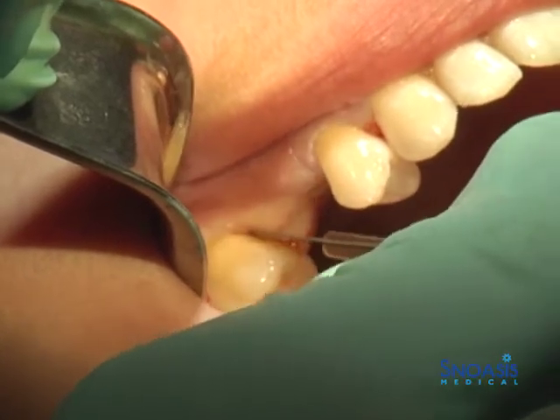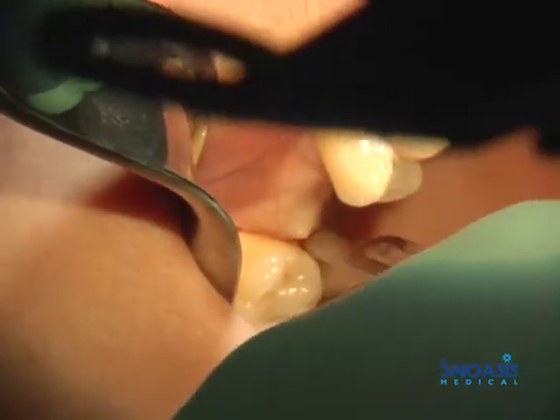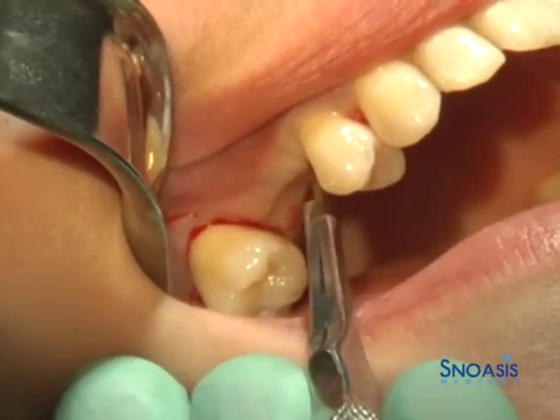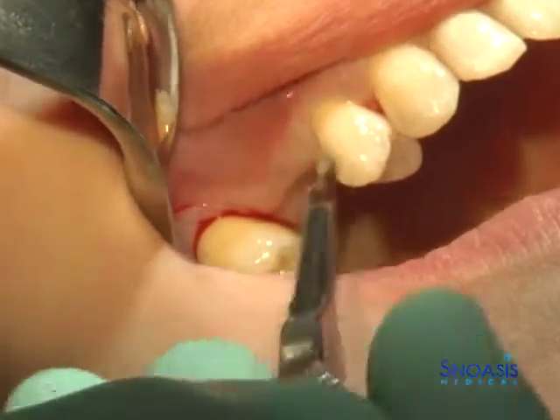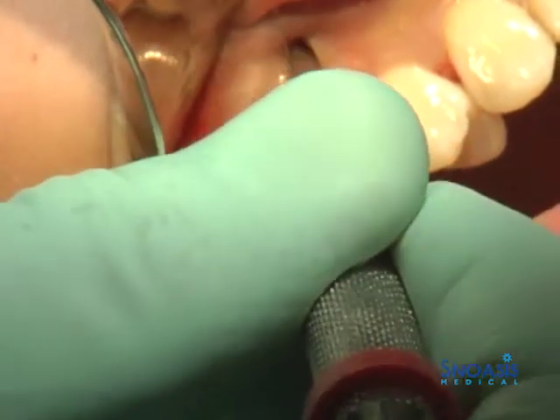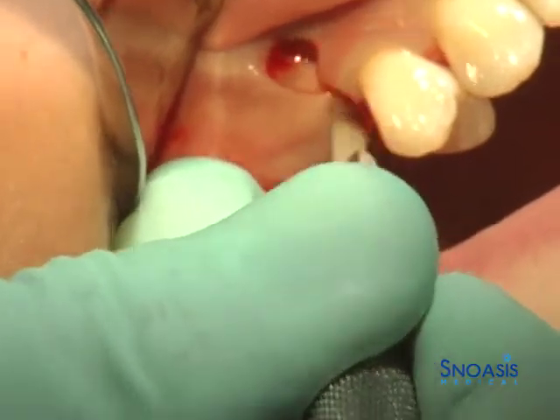After a 30-second chlorhexidine 0.12% mouth rinse and appropriate local anesthetic, the patient has a full thickness trapezoidal mucoperiosteal flap elevated in the area of tooth number four. Full thickness flap reflection is accomplished past the mucogingival junction to expose the lateral wall of the maxillary sinus.